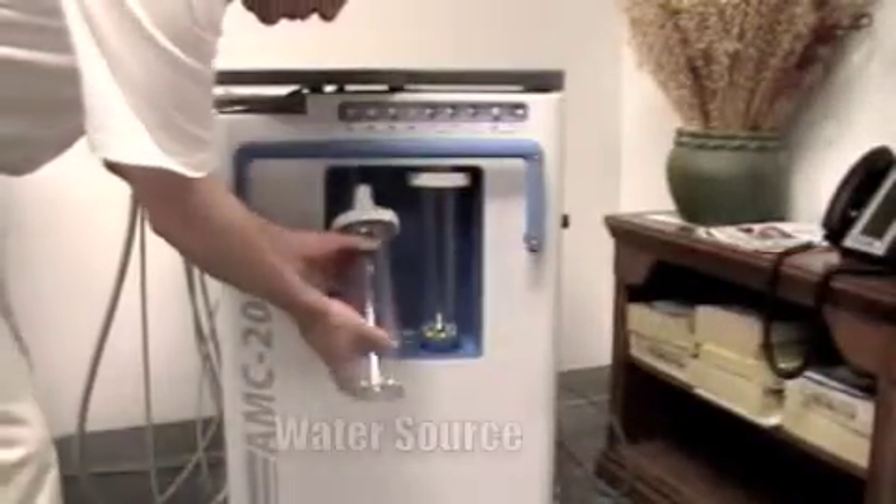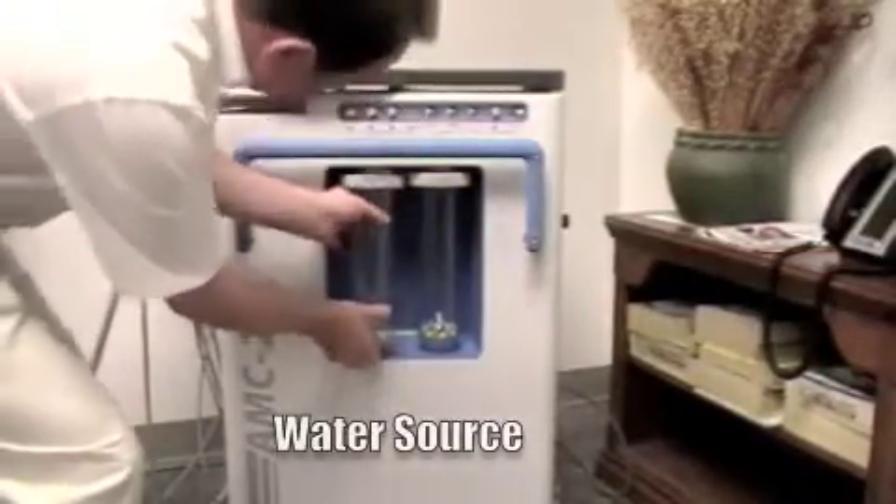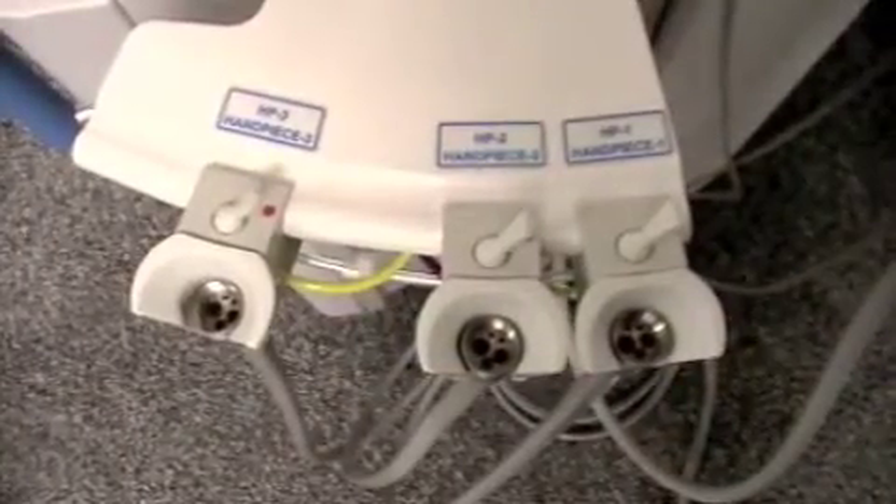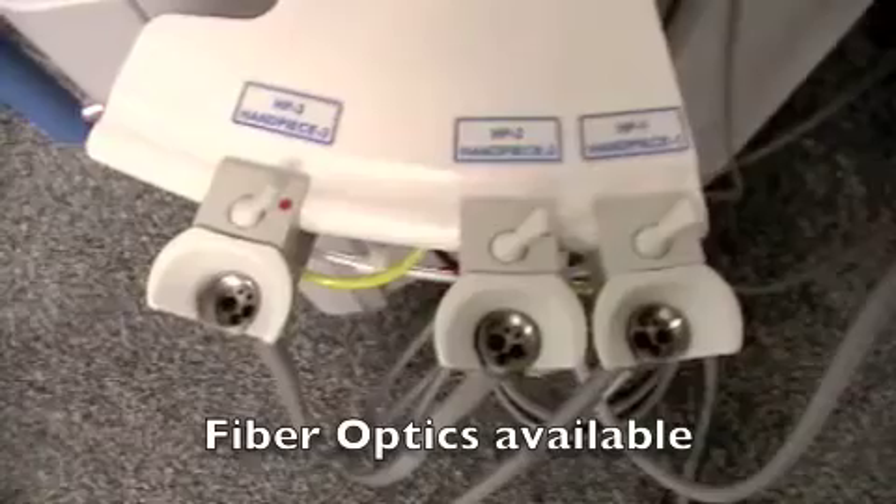Fill the water bottles with the desired irrigant and secure them into place. Distilled water is recommended for most procedures. The standard AMC20 has three Midwest handpiece connections with lockouts.